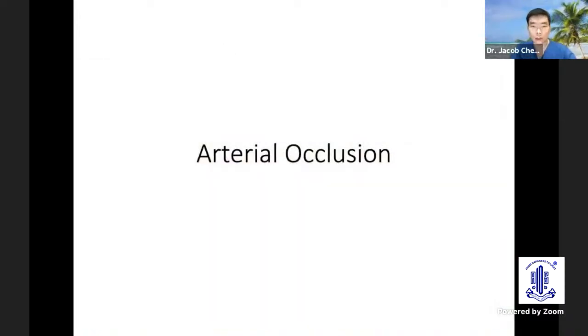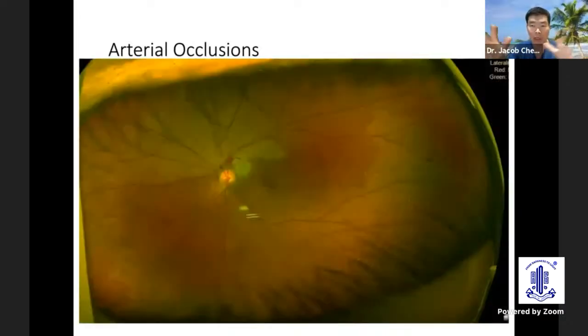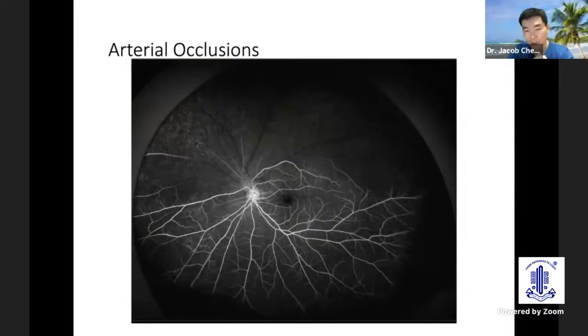How about in arterial occlusion? Here, on a fundus photograph, you can see whitening, swelling, edema of the superior retina. With the ultra-wide field, you can see the superior, almost hemifield of the left eye is actually involved. This is a fluorescein angiogram, starting with the first picture on your top right, showing the superior hemifield with delayed arm-retinal time. In the magnified view, you can see the delay, but also that the macula or fovea is not really involved, fairly well perfused. The patient actually has pretty good vision, except for a bit of patchy inferior field defect.